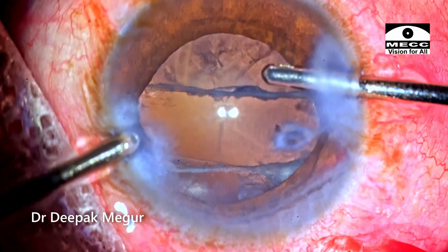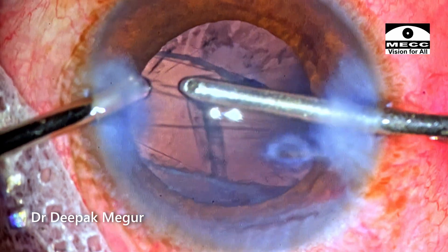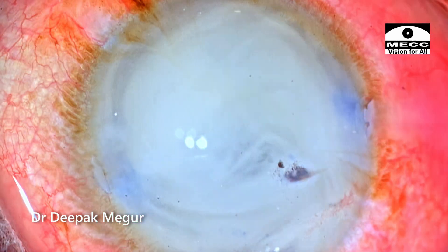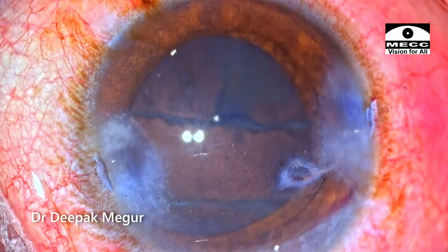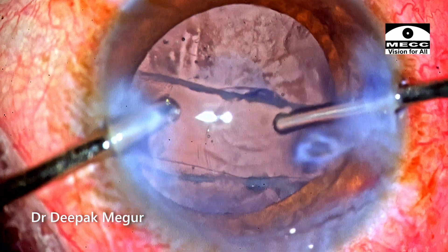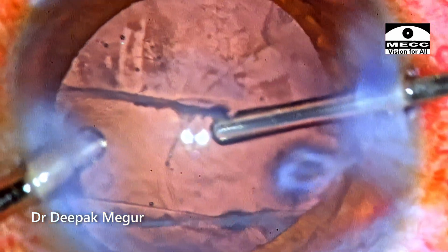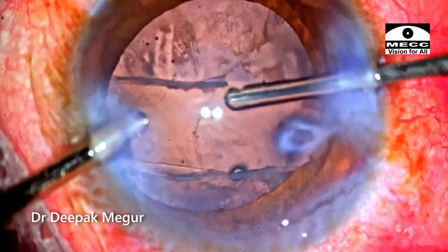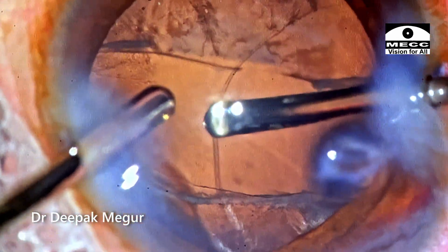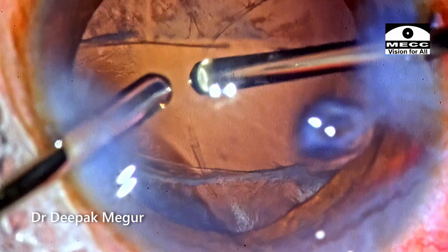This is probably the most important take-home message from this video. Once the vitrectomy is completed and I'm satisfied there's no more vitreous, I need to trim the capsular edges. First I begin by trimming the anterior capsule edge, which is quite fibrotic because of inflammation and because some duration has passed. I also trim the posterior capsular tear because the cut edge is coming exactly in the visual axis — just a few cuts to ensure the posterior capsule margin does not fall in the visual axis.